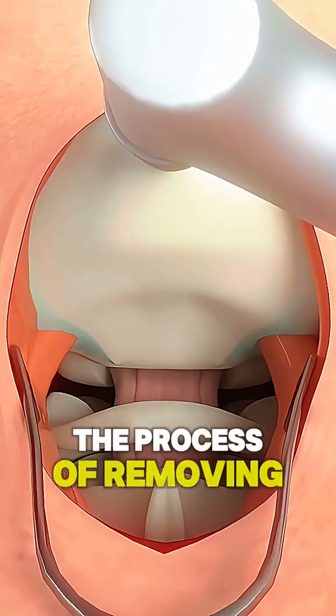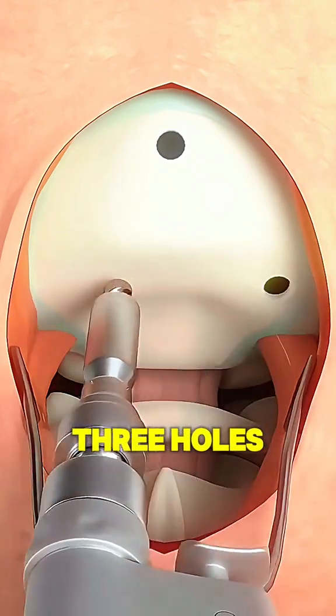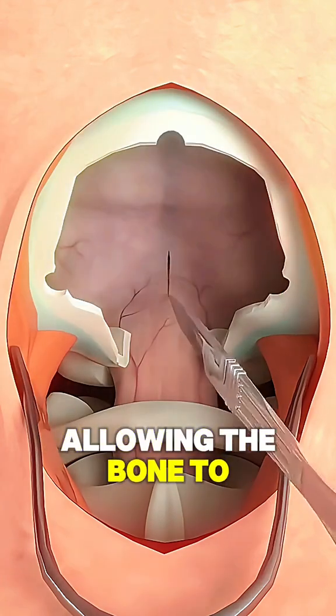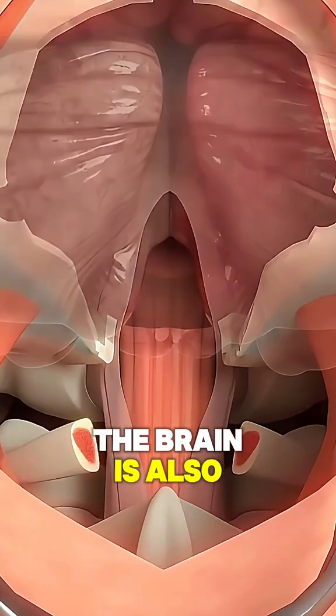Next, the process of removing the bone begins. Using a drill machine, three holes are made on the bone one by one. Then, a cutter is used to connect these three holes, allowing the bone to be completely removed. The connecting bone of the brain is also cut and taken out.